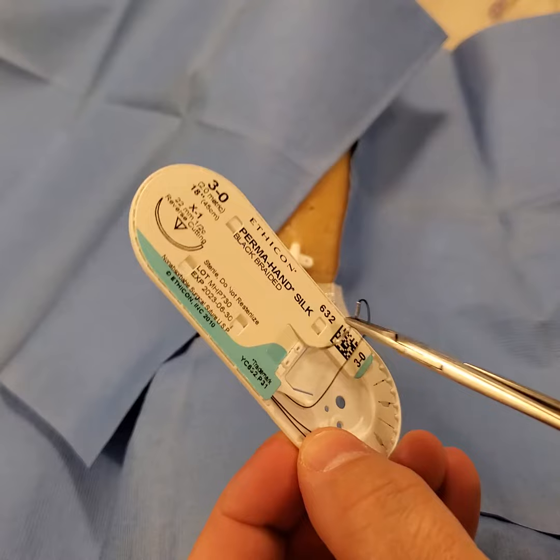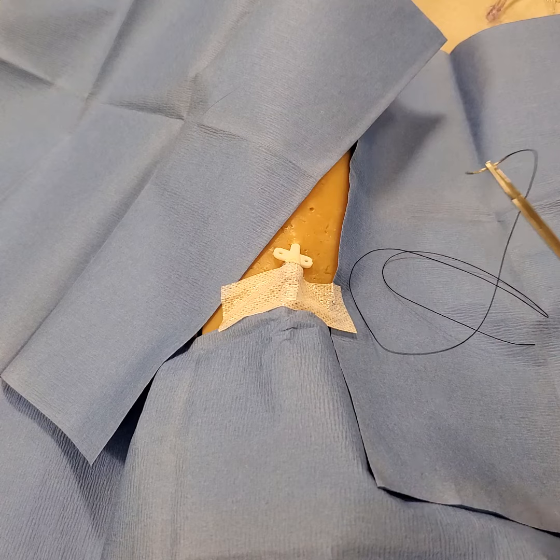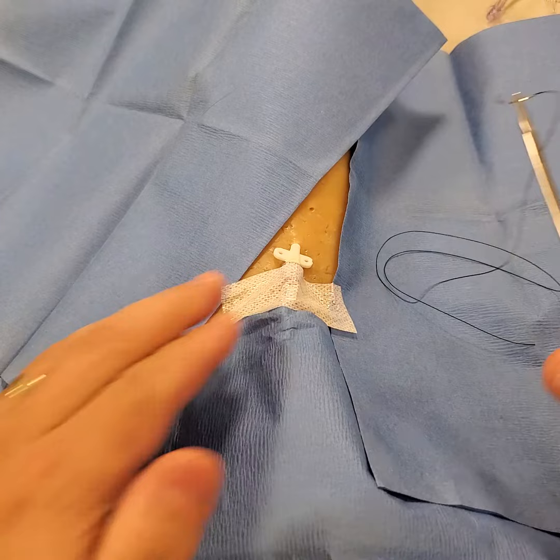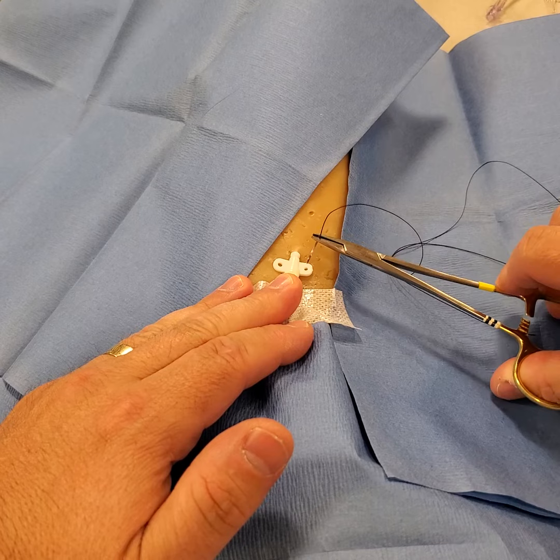Grab your silk and pull it out. I tend to hold it not clamped tight, but just with pressure. I'm right-handed, so I'll start with my right hand and start on the right side. There's no true correct way, except you can go from the outside, create your bite under the skin and come up through the hole.